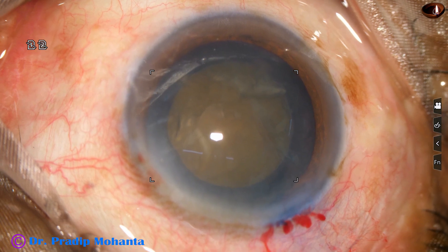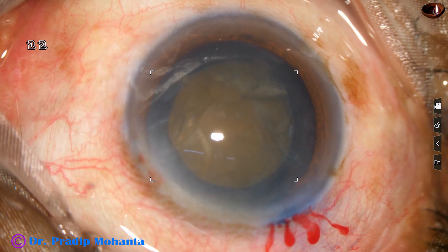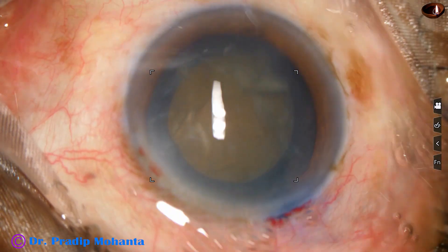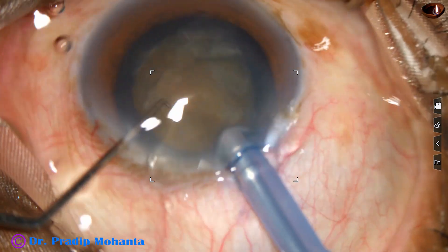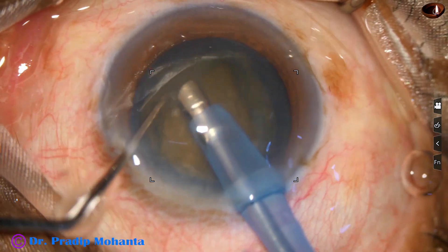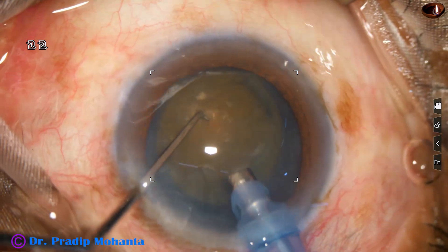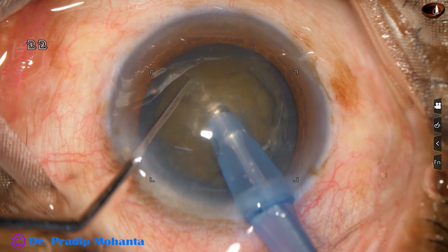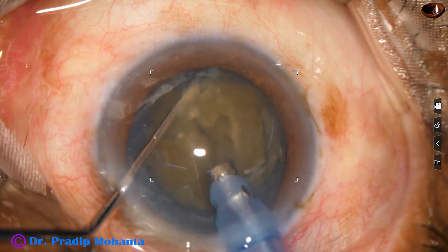The tip of the phaco needle goes in. The machine being used is Oatly, and this is the Oatly Easy tip. Some superficial cortical lens matter is removed. And then the handpiece is turned to make the bevel up, and the tip is buried into the substance of the nucleus, going towards the opposite equator through the substance of the nucleus. And the nucleus is chopped.